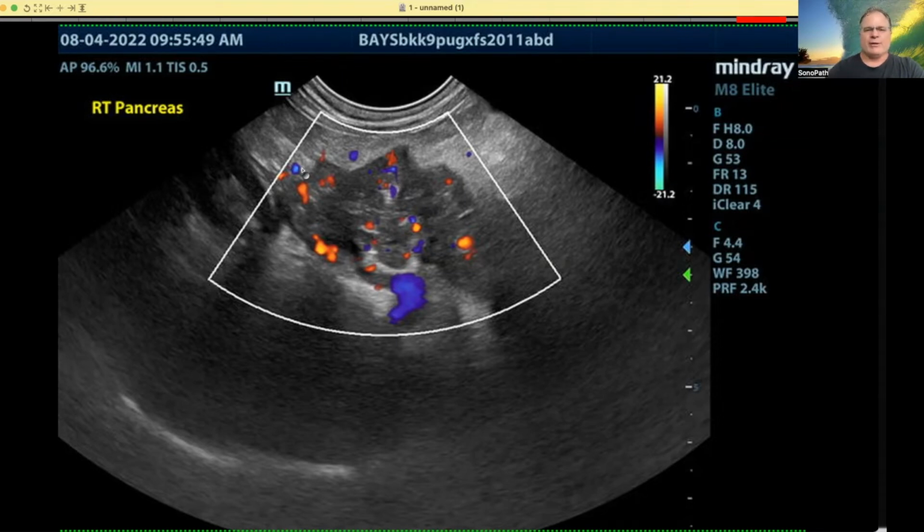And so obviously this first still image we have, this is duodenum. This is the end of the C loop, or you get this on S-step 8B, where we get the pancreas, or S-step 14, where we're swinging around off to the C loop after the right kidney and pyloric outflow. So this is the base of the pancreas, or right base of the pancreas. You can see all this hypoechoic irregular tissue.